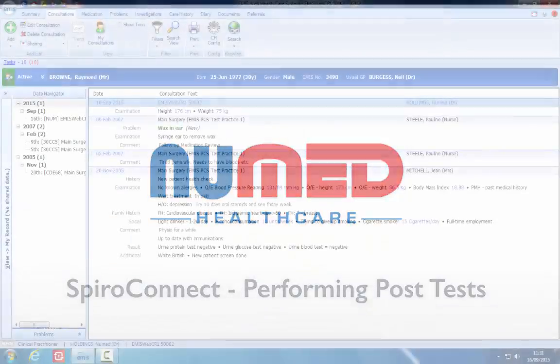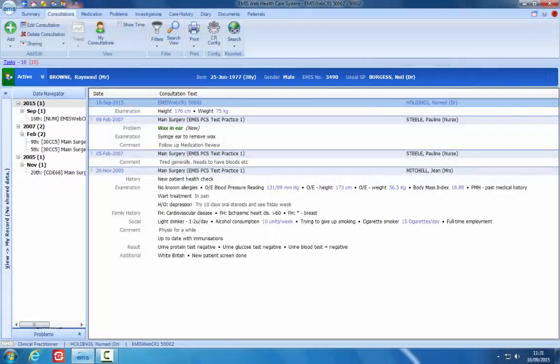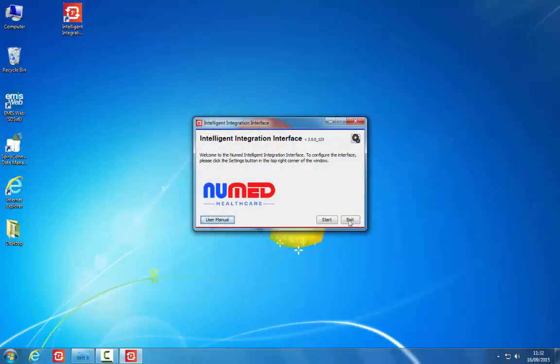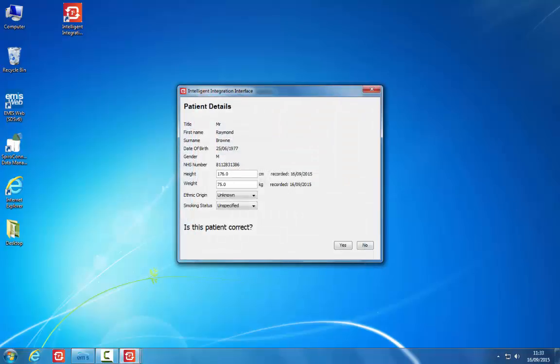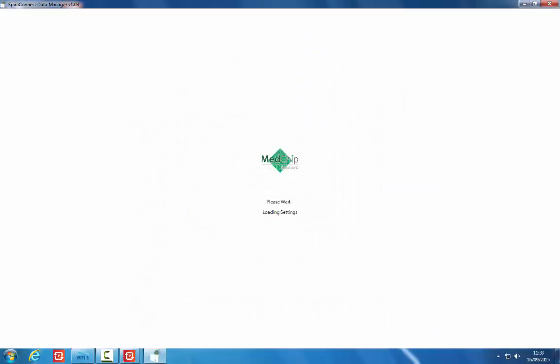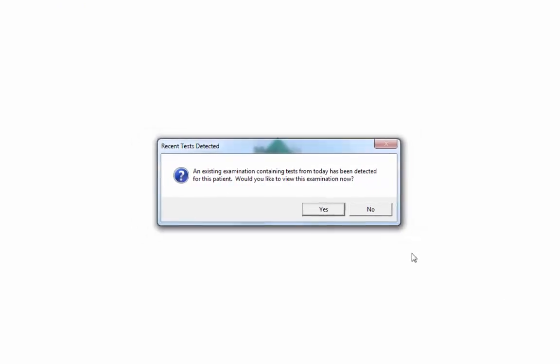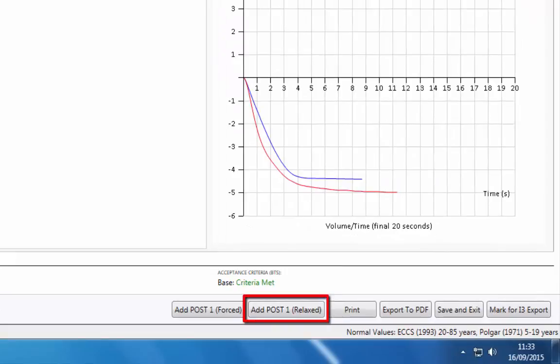Performing post tests. When the patient returns to the room, load the patient record in the clinical system and click the i3 icon on your taskbar or desktop again. Verify the patient's details are correct by clicking Yes. The SpiroConnect software will start automatically and display a message that recent tests have been detected. Click Yes to view this examination. If you want to record post relaxed blows, click the Add Post 1 Relaxed button.